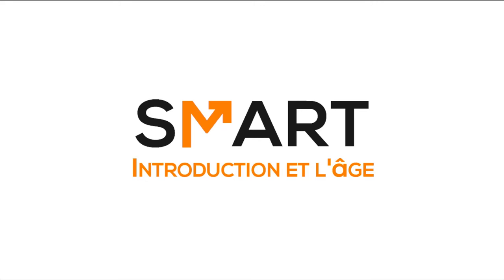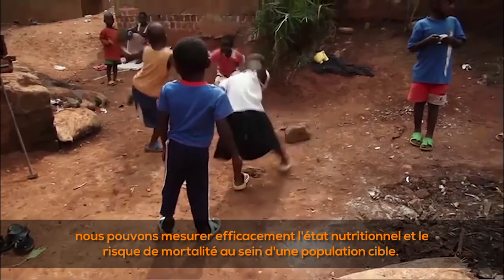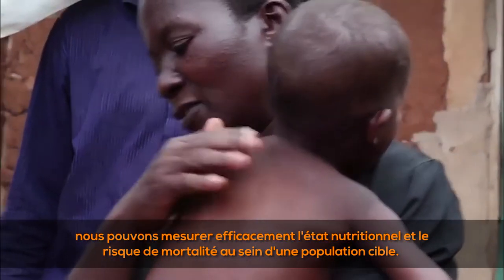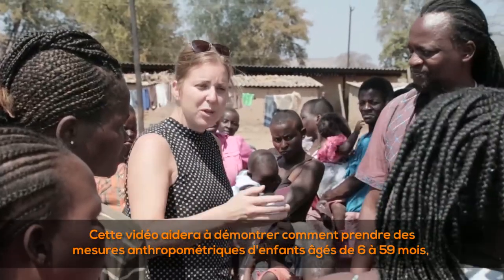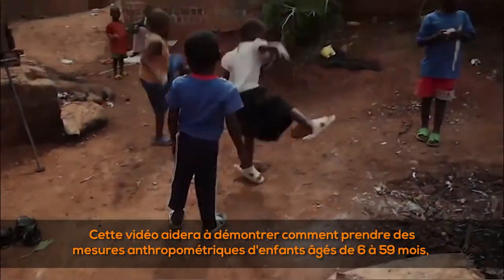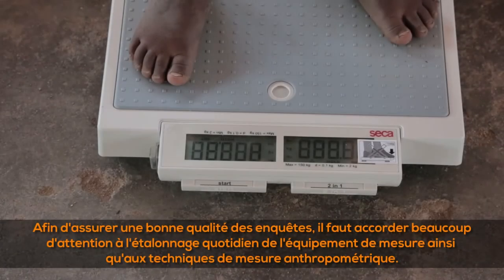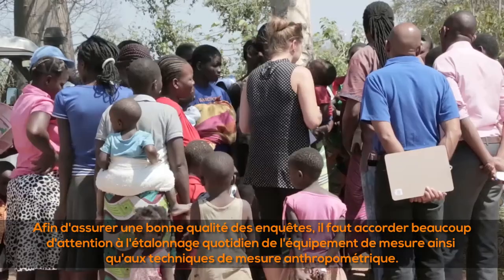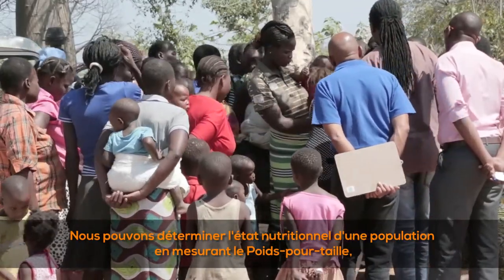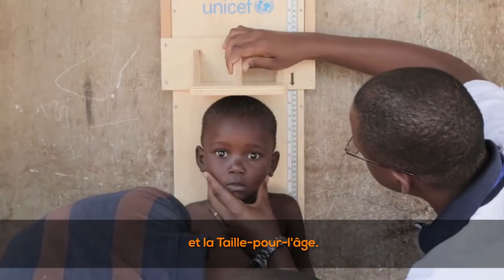By taking anthropometric measurements of children between 6 and 59 months, we can effectively measure the nutritional status and risk of mortality within a target population. This video demonstrates how to take anthropometric measurements of children aged between 6 and 59 months and how to create an events calendar to estimate a child's age. Much attention should be paid to the daily calibration of measuring equipment and anthropometric measurement techniques. Nutritional status is determined by measuring weight-for-height, weight-for-age, and height-for-age.